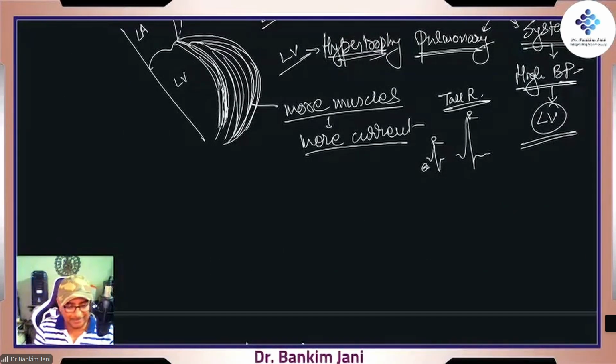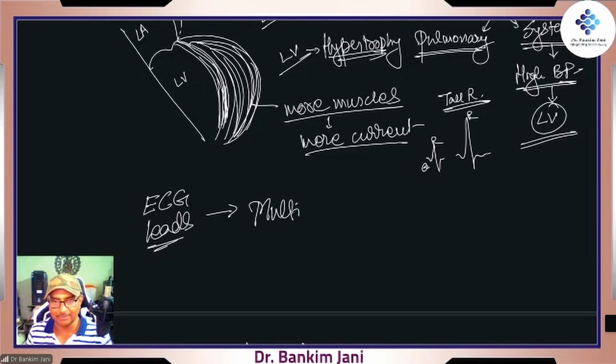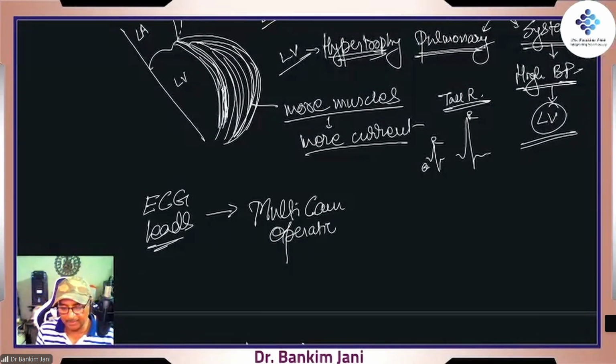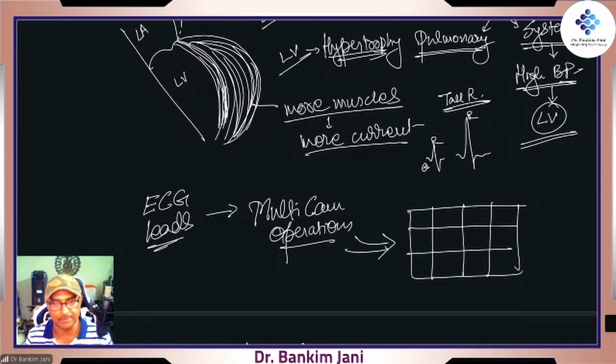Yes, I many times use this analogy: ECG leads are like those CCTVs you must have seen. ECG leads are nothing but multi-camera operations. Multiple cameras are watching the heart, and the representation of it is nothing but the ECG.